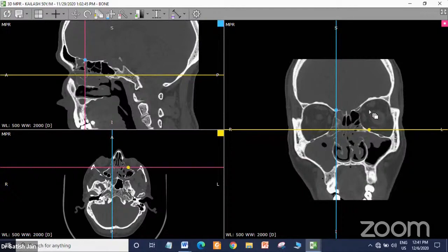and the kind of CT scan required. So the role of CT scan is not for diagnosis. 99% of the time, sinusitis can be diagnosed on clinical grounds. With clinical history, the most important is the history and then endoscopy. The CT scan is required to give you anatomical details for surgery, to rule out any other thing than sinusitis. That is the second reason to order CT scan.